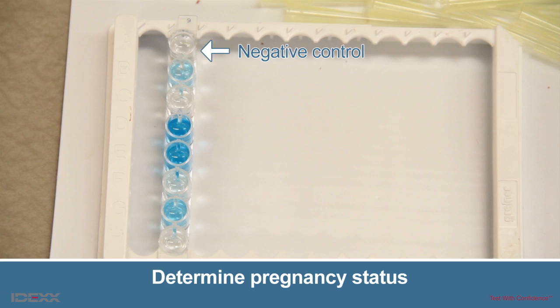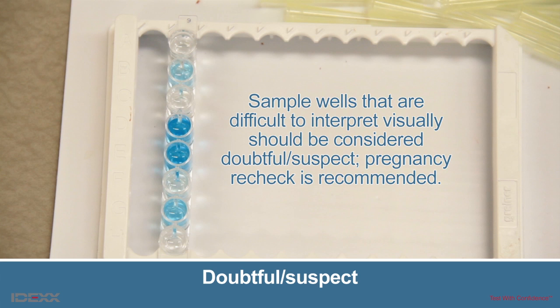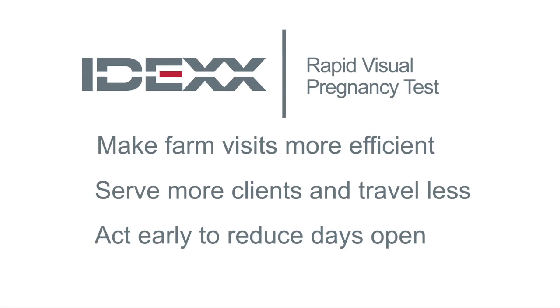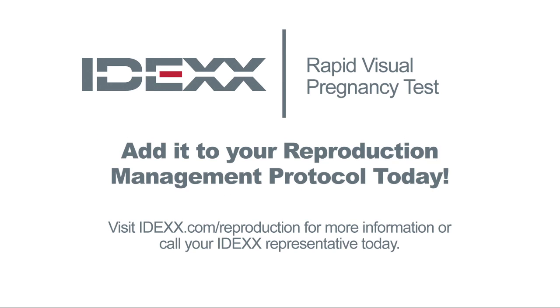If the color development of the sample well is less than or the same as that of the negative control well, the animal is considered not pregnant. If color development of the sample well is greater than the negative control well, then PAGs are present and the animal is considered pregnant. Sample wells that are difficult to interpret visually should be considered doubtful and pregnancy rechecked as recommended. This concludes your training of the IDEXX Rapid Visual Pregnancy Test. Please contact your sales or technical support representative if you have any questions.